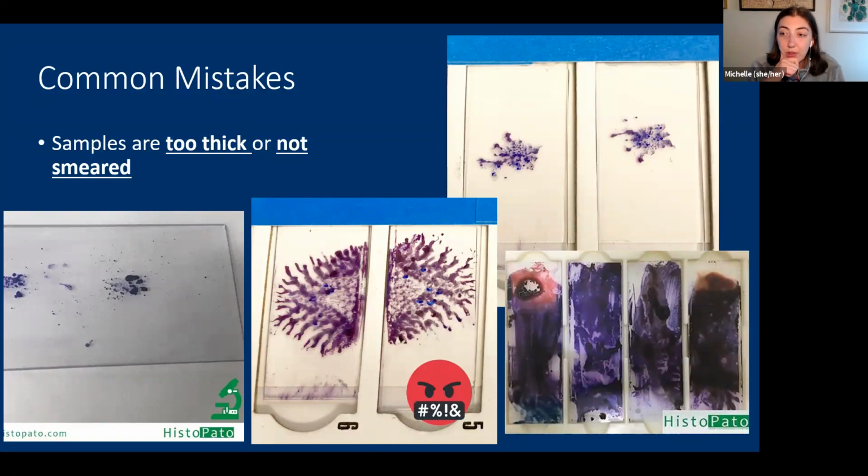Sometimes people submit liver samples that were prepped like a blood smear. I wouldn't recommend that. I would only use the blood smear method in addition to a normal smearing method, if you think you did not have a good preparation, and with very fluidy or very, very bloody samples.